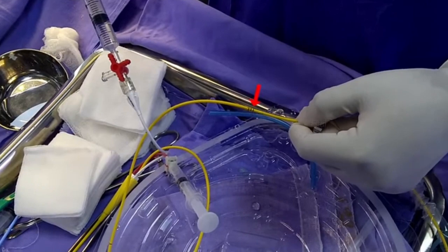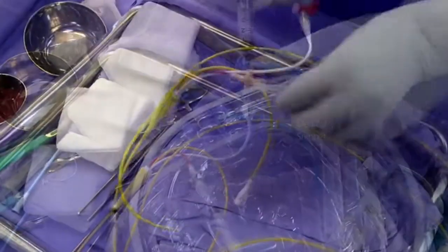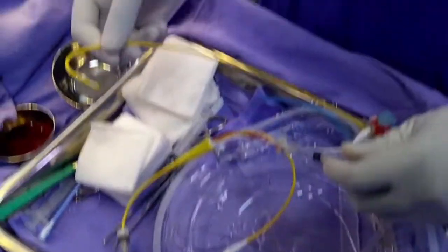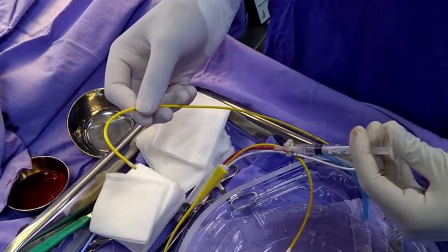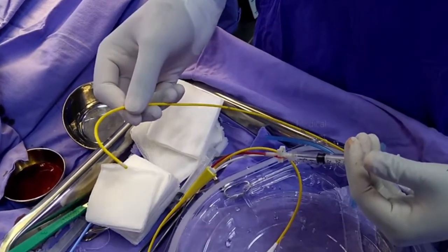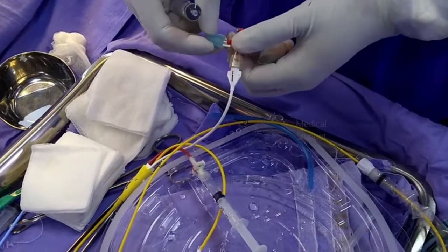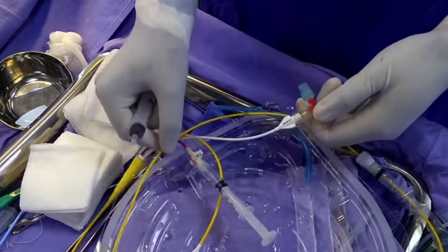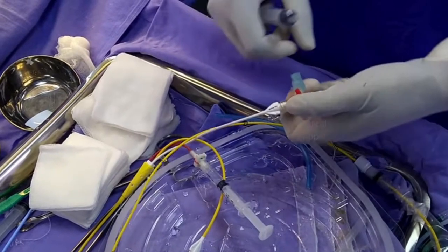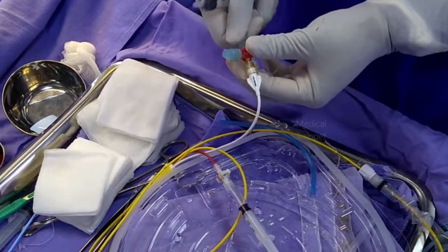The lumen terminates at the 30 centimeter. We also check for balloon inflation prior to insertion, and then hook up the pulmonary artery catheter to pressure monitoring. The provider will be guided when it's ready for insertion.